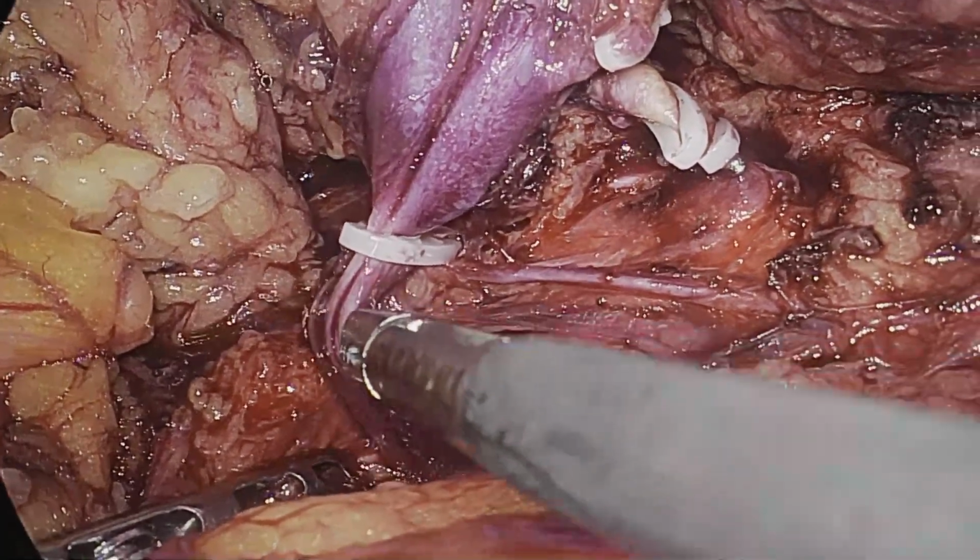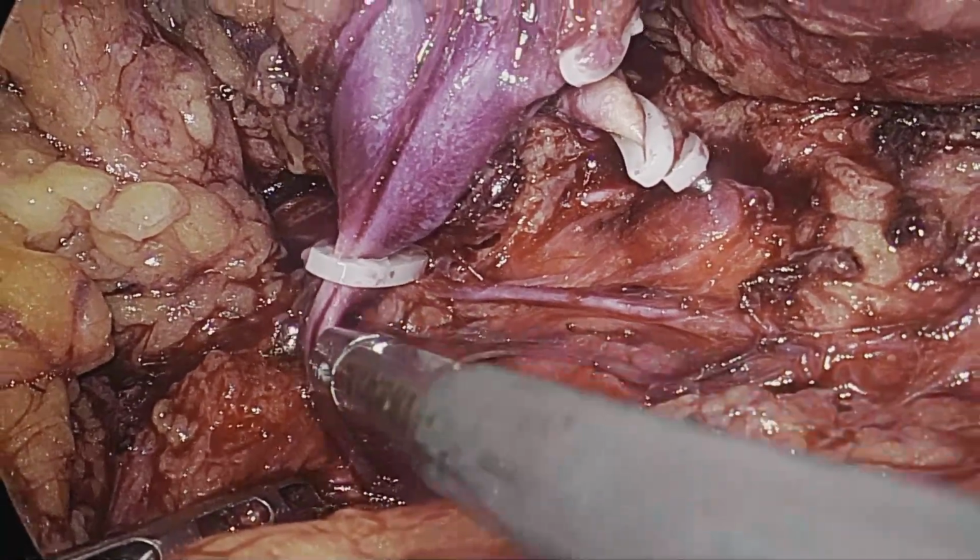So more proximal dissection has been done, and proximal clipping of the vein was done here.